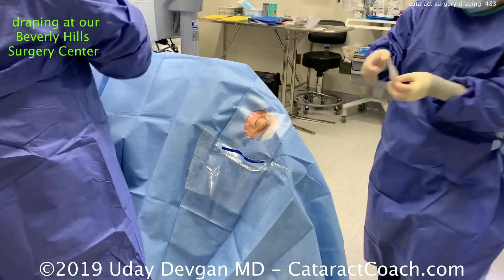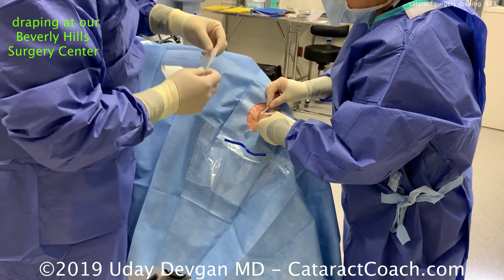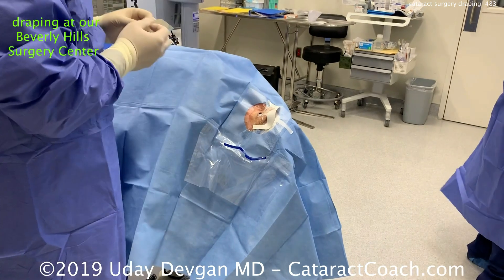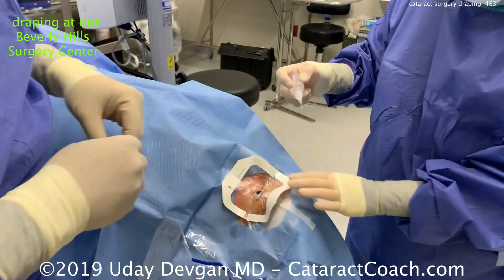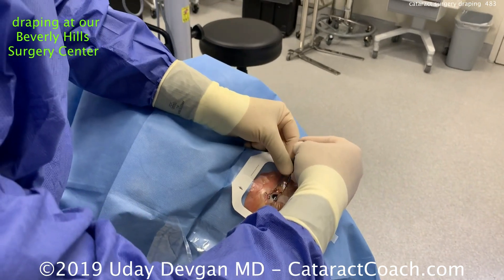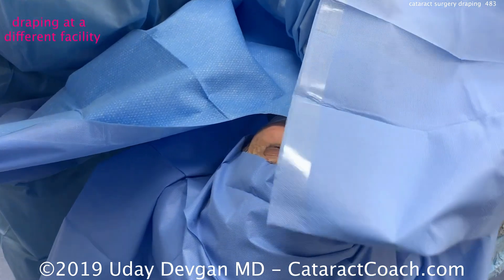My assistant will use a Steri-Strip and the back end of a Wexel to lift up that upper lid, then place the Tegaderm to get every single eyelash out of the way. We'll do it for the lower lid as well. Without touching the skin at all, we're able to drape it so that every single eyelash is out of the way and there's a clear plastic drape around the lid margin.